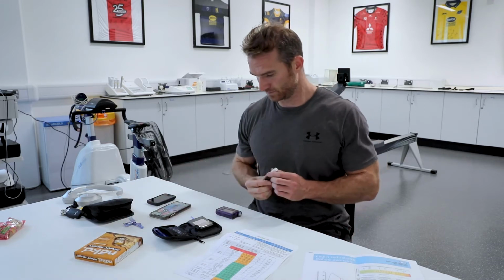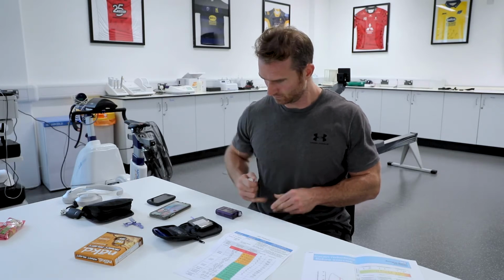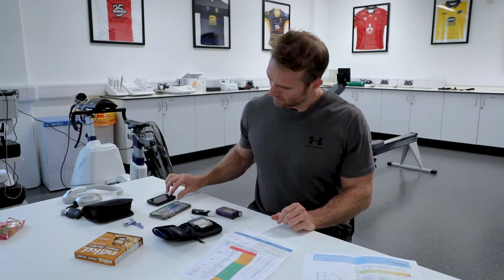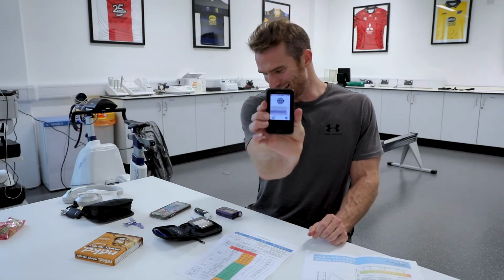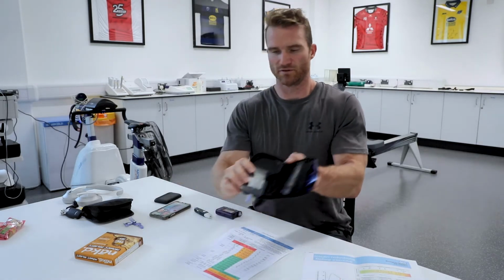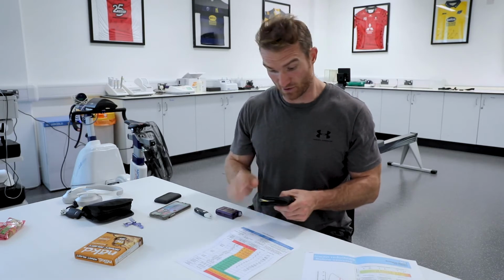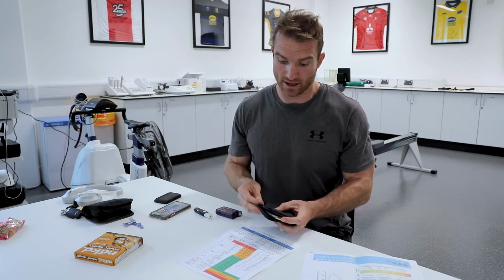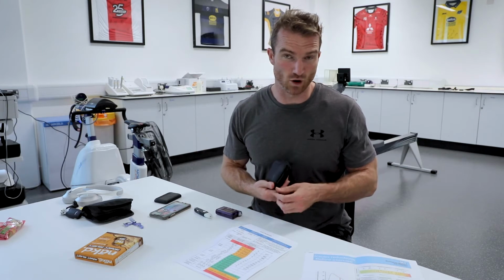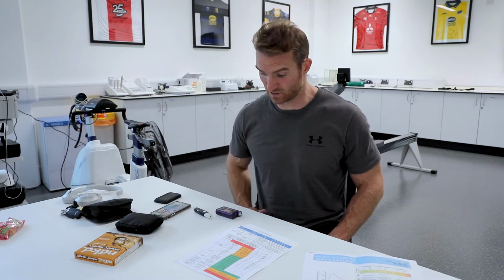My glucose level now. On the continuous glucose monitor, it says 8 and steady. On the finger pricker, it says 7.1 and steady. As I said before, as long as it's within 15% of the finger prick, which 8 is within 15% of 7, that's absolutely acceptable. That's the level of accuracy within 1.5 that you're going to achieve. It's important to know that they'll never be exactly the same, and if you're expecting that, you'll be disappointed.